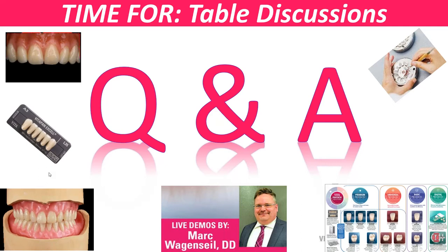So you can still gain that when you have your models and your bite taken and where you need to set the anterior teeth. And then how am I going to set the lower? Don't be scared now. Challenge yourself. And if you need to overbite it a ton, that's okay, because now you have freedom, and freedom is good.